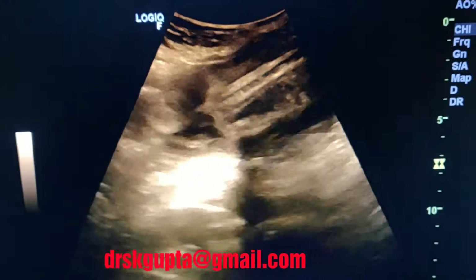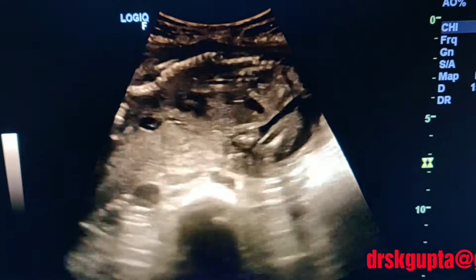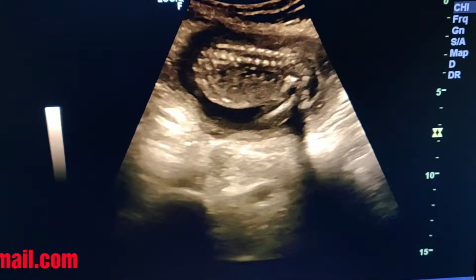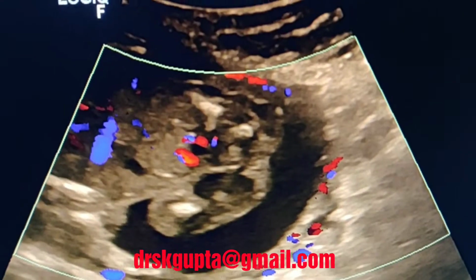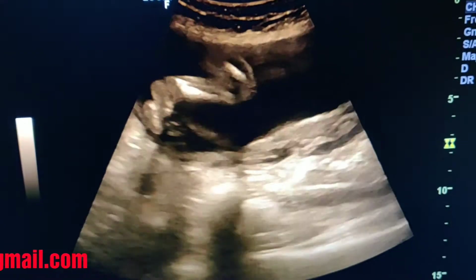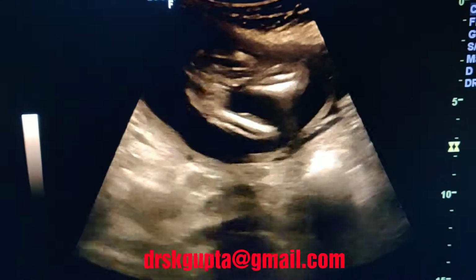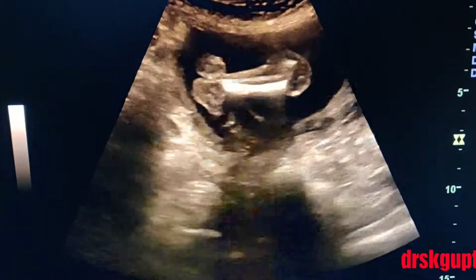This is the spine of the baby. Once you see the spine, you have to see the spine from the top to bottom, because there can be myelocele at the lumbosacral region, which may be missed out if you see half of the spine. These are the feet of the baby. Always make an effort to see all 4 limbs, that too in detail, because it can be catastrophic if a baby is born without a limb.